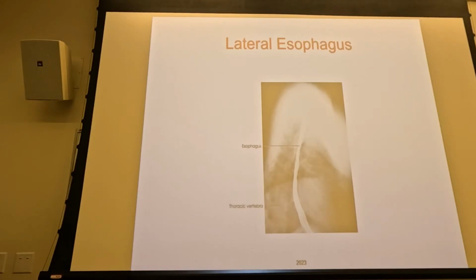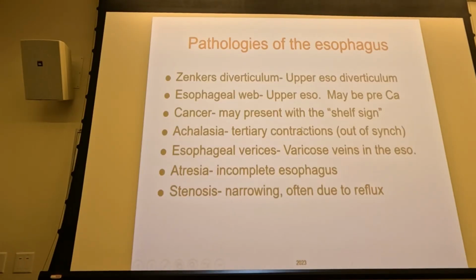Okay, it should look like that. Could have got a little bit better. The arms could have been elevated a little bit better, to remove some of the soft tissue and get a little better visualization of the upper portion of the esophagus.